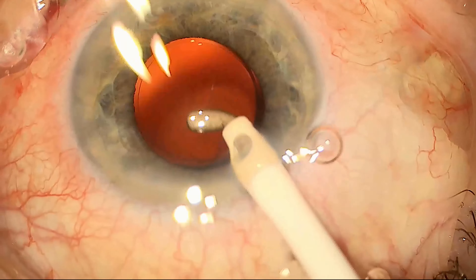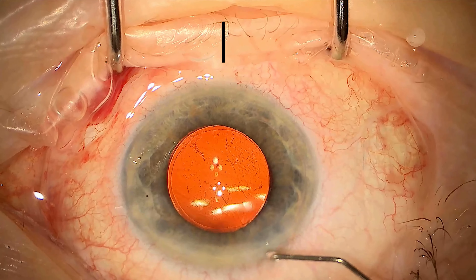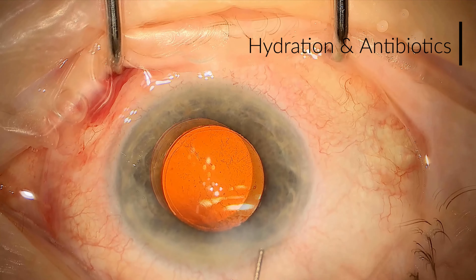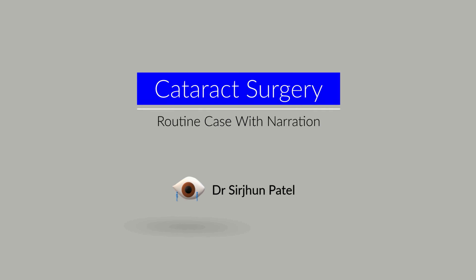We remove the viscoelastic and just tighten up the wounds with some hydration, and finally some antibiotics into the eye, and that completes the operation.